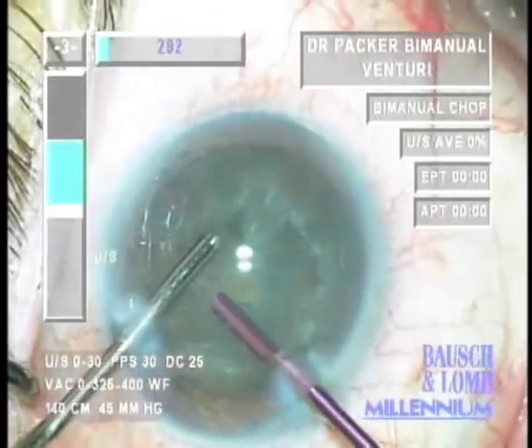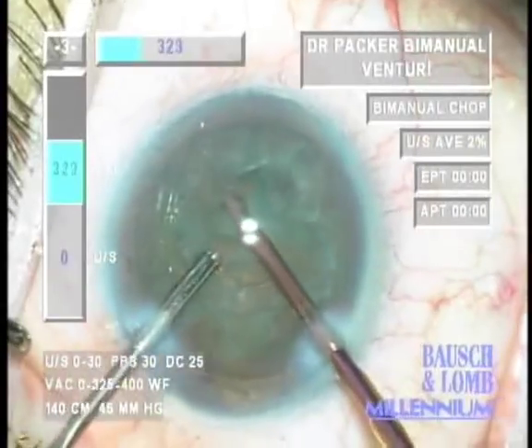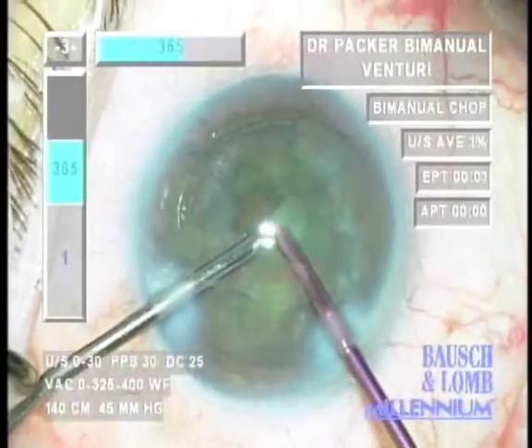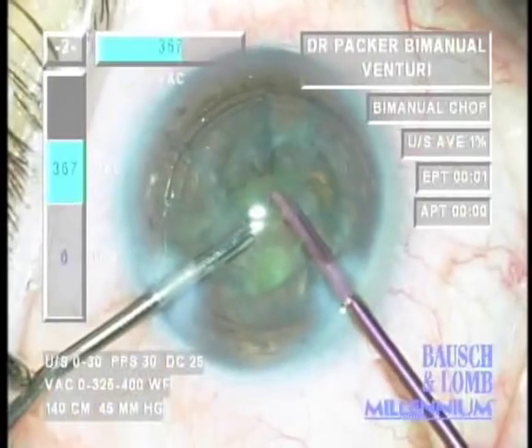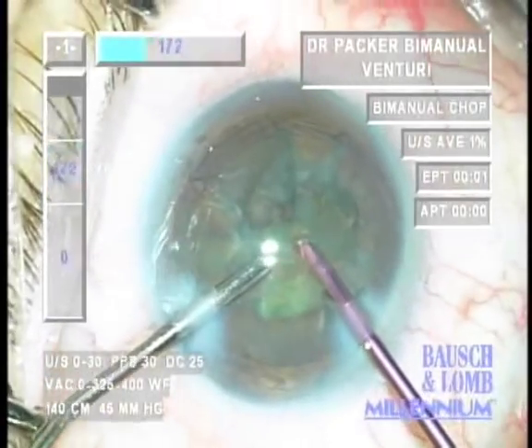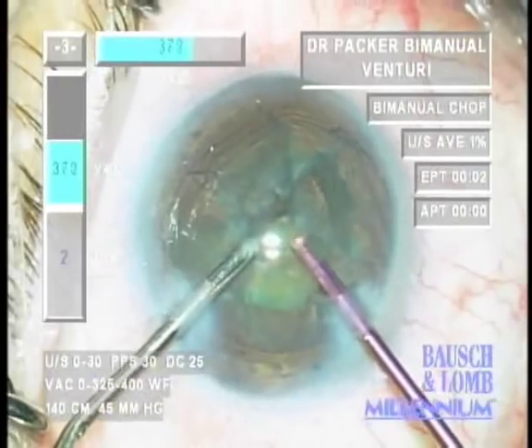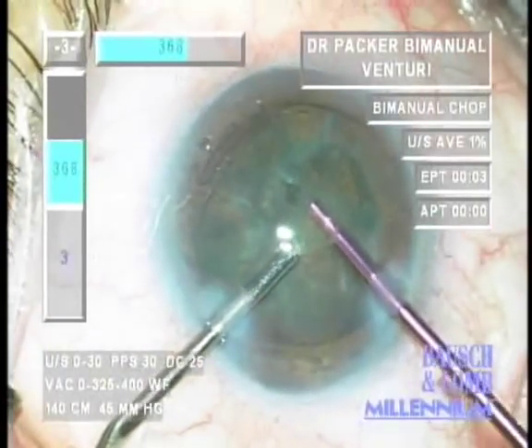The Venturi system on the Bausch & Lomb Millennium is particularly effective for bimanual microincision FACO. The high vacuum control with minimal surge is excellent for withdrawing material using minimal ultrasound energy. Aspiration and emulsification of this segment shows only 1% average power and an adjusted FACO time of zero seconds — only one second of elapsed FACO time. Very little ultrasound is being used; vacuum is doing the work to extract this material.